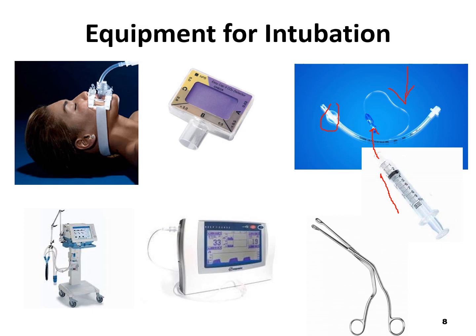You will also need an end-tidal CO2 detection device. So there's the colorimetric one that will flash color. Once it's at the end of the endotracheal tube, once the patient is intubated, when the patient exhales, the color will flash across the screen indicating that there is CO2. Or a better way is if you have a waveform capnography, which would show in this picture down here that you have waveforms. And these waveforms show that the patient is actually intubated, and that is end-tidal CO2 coming out.